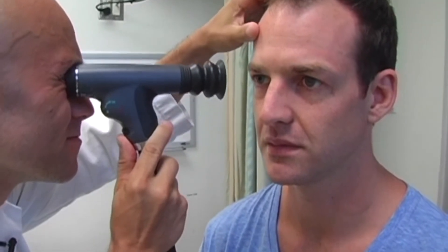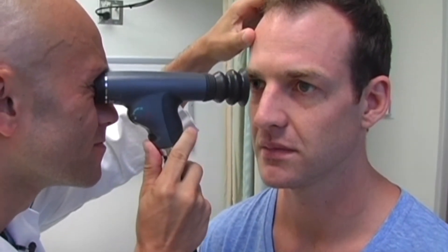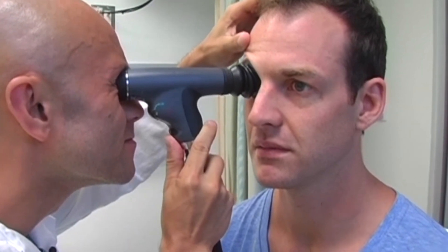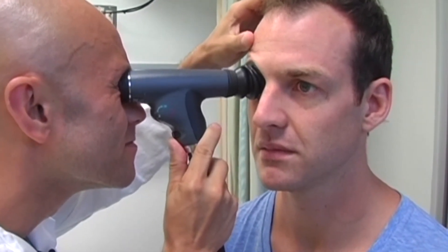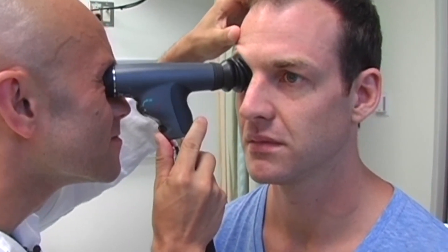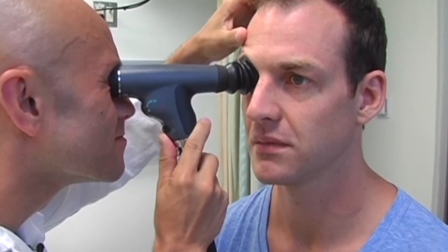Locate the red reflex and move the scope toward the patient, keeping the red reflex in view. Maximum view should be obtained when the eye cup is compressed by half. You may examine both of the patient's eyes with your dominant eye on the scope. Make sure you wipe off the eyepiece with antiseptic solution after each use.